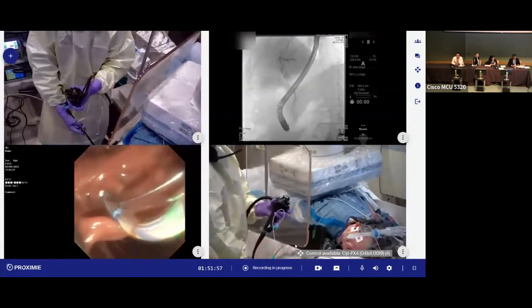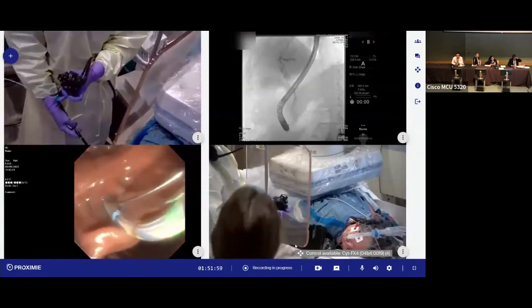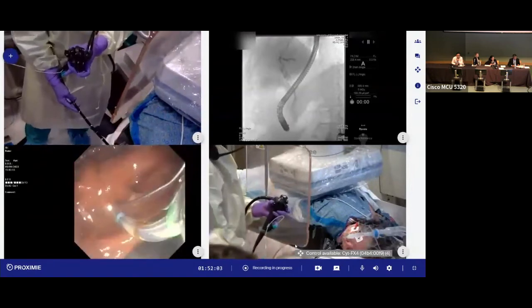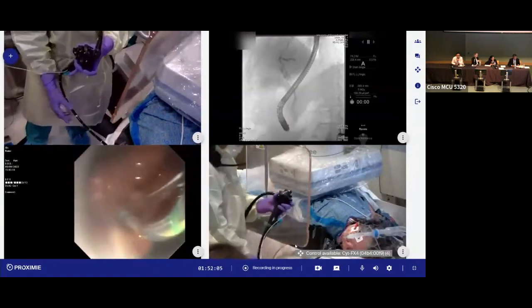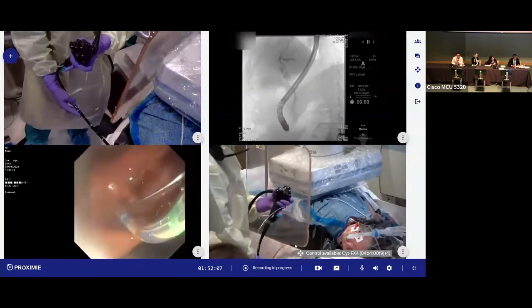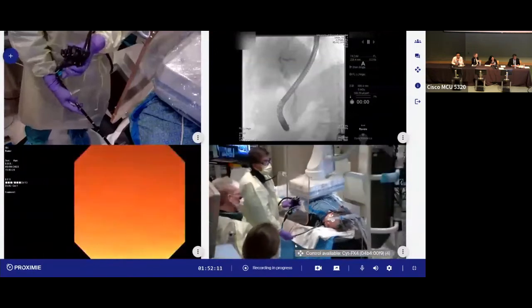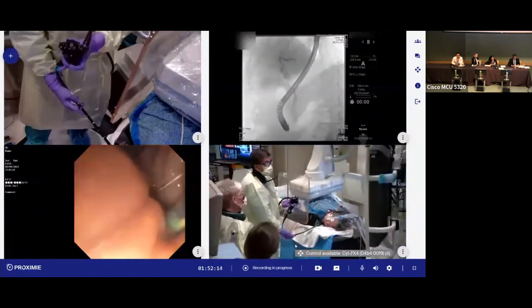Do we have the endo view there? Can you guys see the endoscopic view and your hand view too? Okay, there we go. That's a lot of talking on my part. But I'm using my right hand to push the duodenoscope slightly. And of course, can't see now.